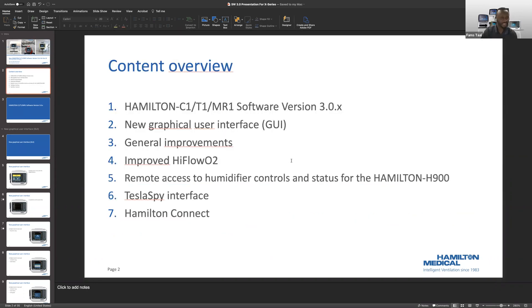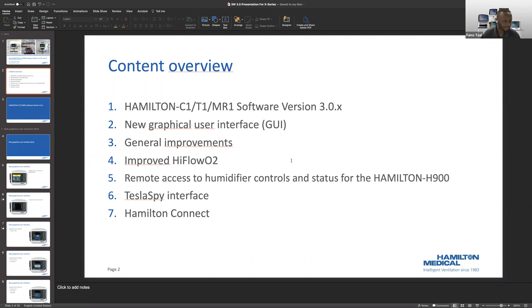The content overview of what I'm going to present: we're going to talk about the 3.0 software update on the T1, C1, and MR1. There's a new graphical user interface we'll go over, some general improvements, and improvements to high flow mode. You can also access the H900 humidifier with the newer software update. On the MR1, the Tesla SPI interface has a little bit of an update, and last but not least is the Hamilton Connect.